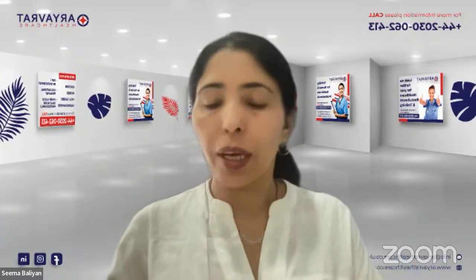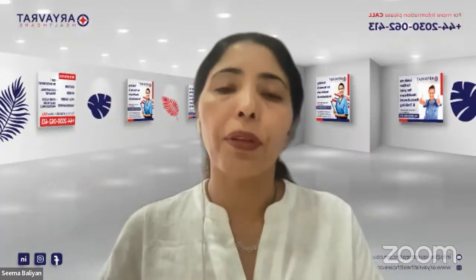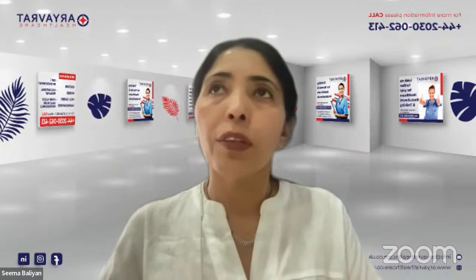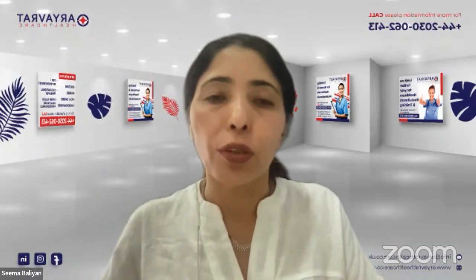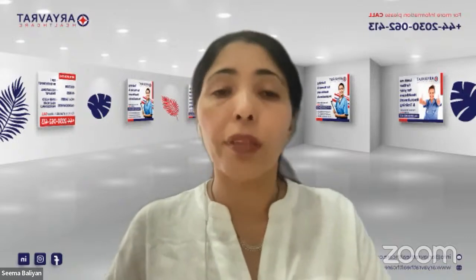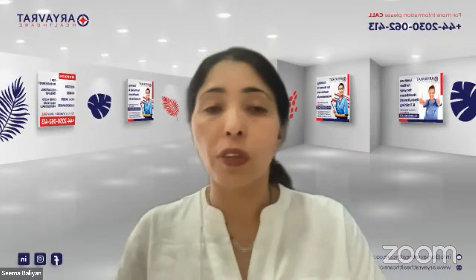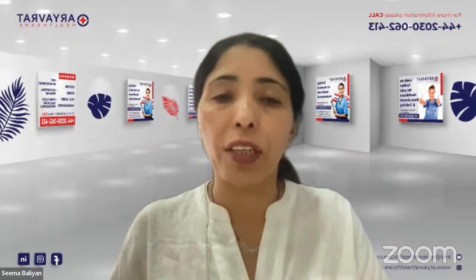I'll tell the patient that I have done your readings, and according to your readings, say for example, there is glucose which is there. So you will tell the patient that I can see that there is some glucose which is present in your urine, which might suggest that you might be having a urine infection. But you can also check with the patient whether they are by any chance diabetic. If the patient says that yes, I'm diabetic, then glucose in the urine can be a finding because of the diabetes. But that does not obviously rule out that there is an infection.